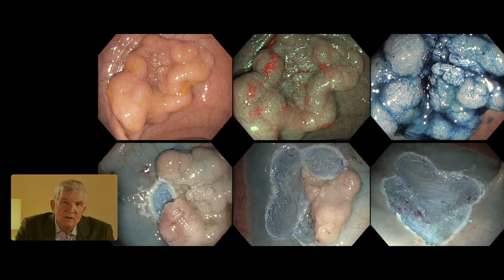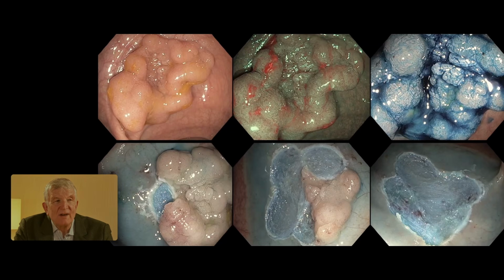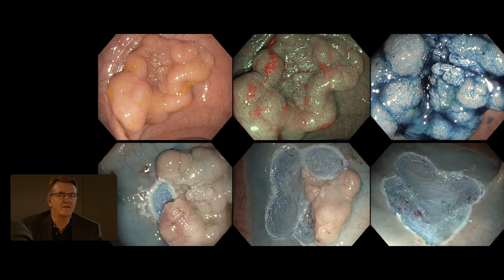So the message is it's a 2A plus C? No, it's not, because that's a pseudo depression. C really means a true depression, which is sharply demarcated. And that's a good point. So it's a relative depression. It's flat in the middle and elevated at the rim, but not a true depression. It's a great example. It is a grey zone. So we wouldn't call this 2A plus C.